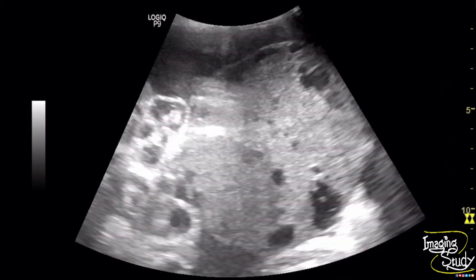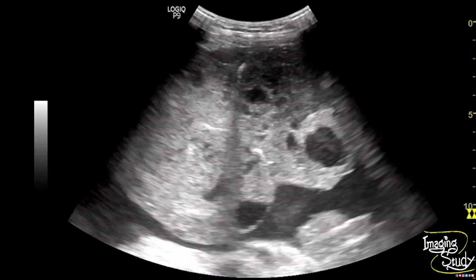Here is the lesion and you can see the solid and cystic components. Here is the calcified area casting posterior acoustic shadow, visible from this part.